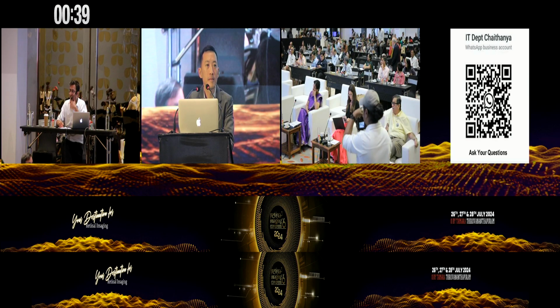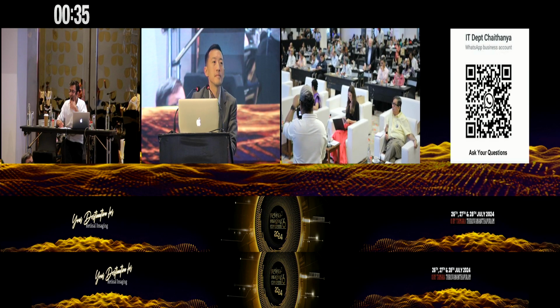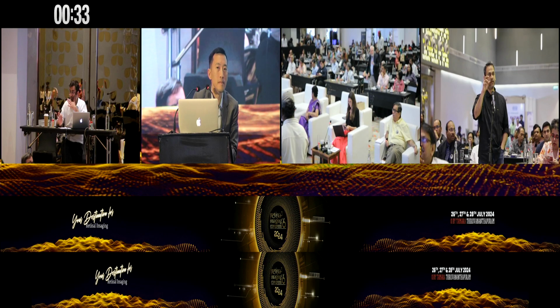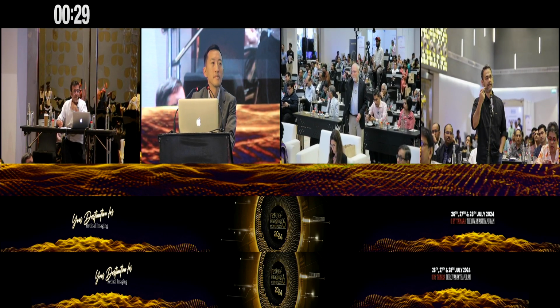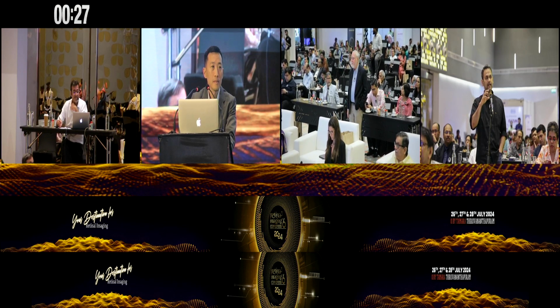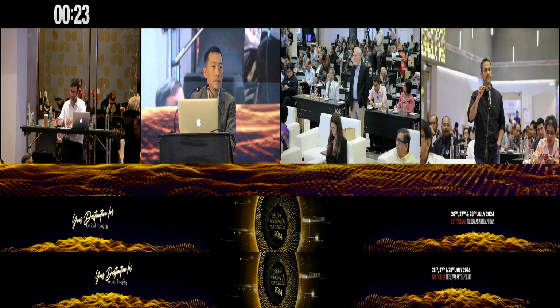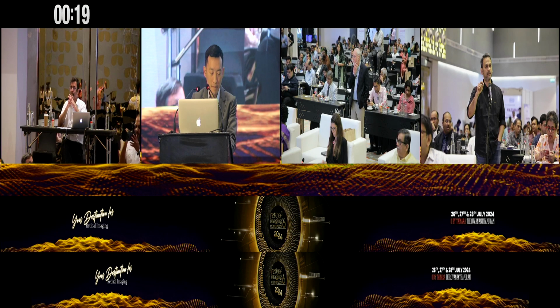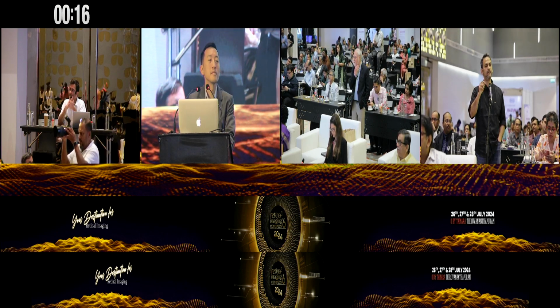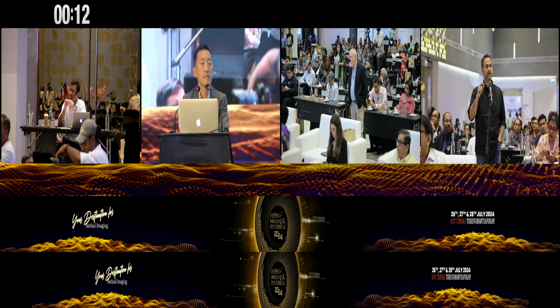Good to see this. You showed the configuration of a cluster of polyps, and you talked about the feeder supplying it. But there are other configurations of PCV, polypoidal lesions, where you see multiple bulbs at the end, and another pattern where you see tiny polyps with the BVN, and some of them without any feeder.